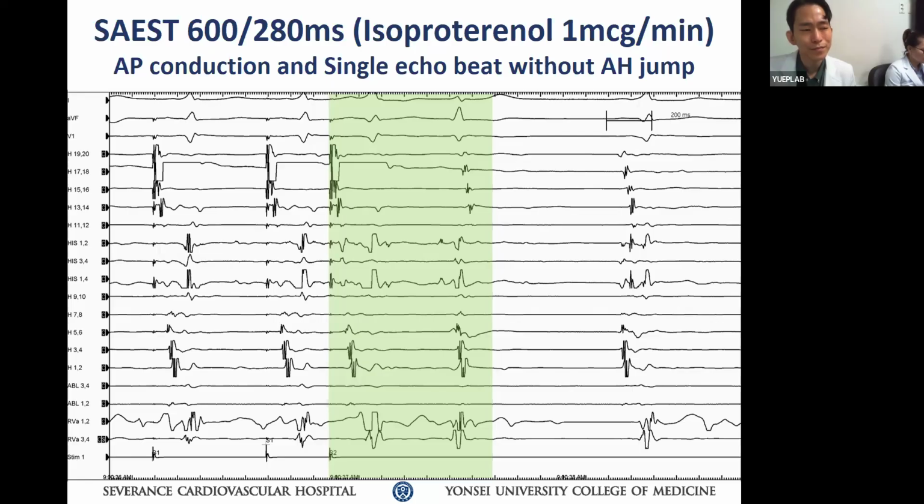Right. But I think it's interesting because when you have a pathway close to the posterior septum, close to the slow pathway area, many pathways will involve some degree of decremental conduction, even though it's not a decremental property, because it's simply an electrotonic nodal conduction issue. So it is a challenging differential diagnosis whenever we are involving not the posterior septum but a little bit more toward the upper septum, and then we get a lot of trouble. So is it possible for the AV nodal conduction to prevent the retrograde conduction?